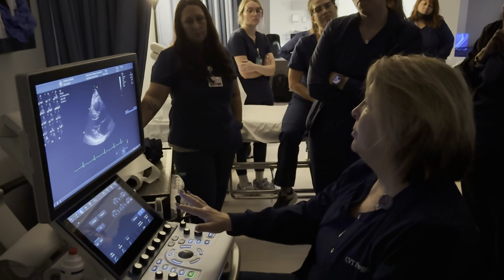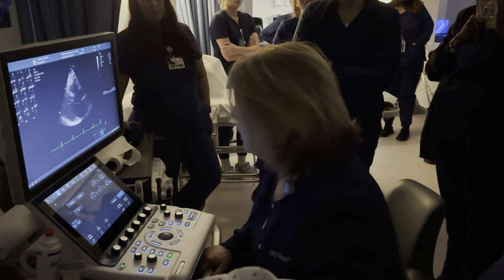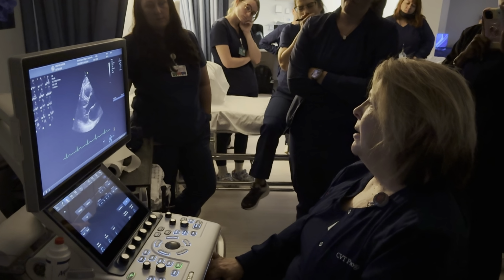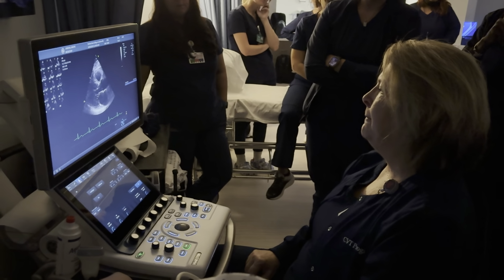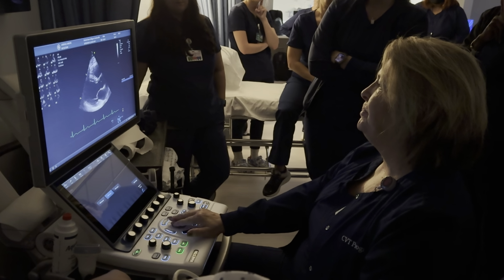I want you to play with it, and then when we come back into lab after the 14th, on the week of the 21st, we're going to start doing color, okay? Color's very easy because right now we're just placing that color over what we're looking at, okay? So let's do M modes here.